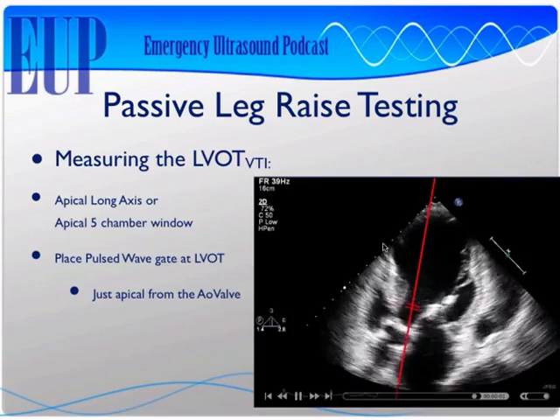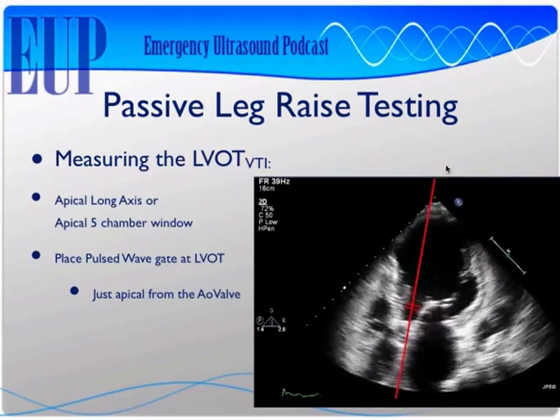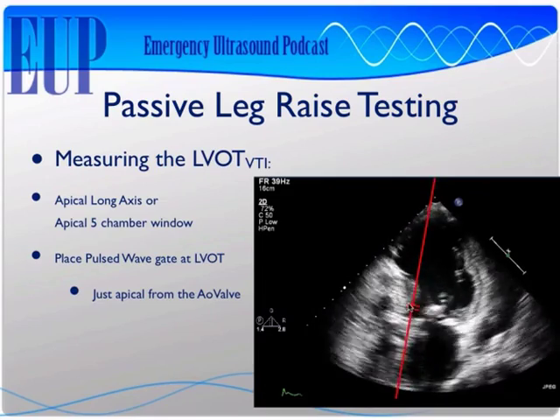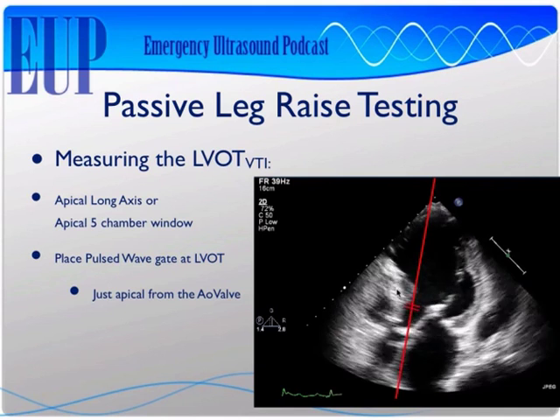Once I find that area, I hit the PW button, the pulse wave button, and I put the gate right in the left ventricular outflow tract. That's where I'm going to measure my VTI.